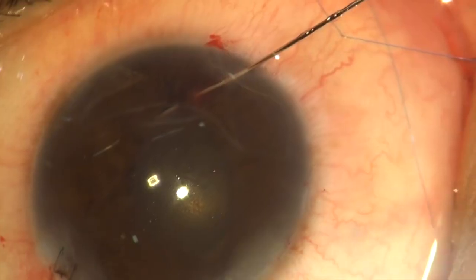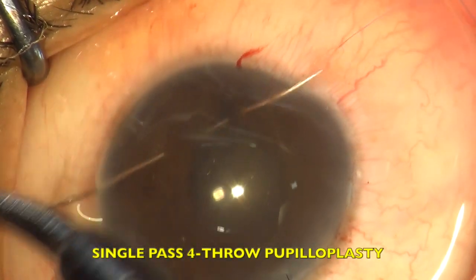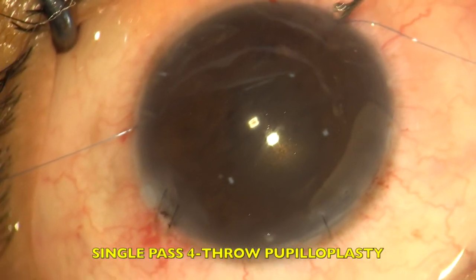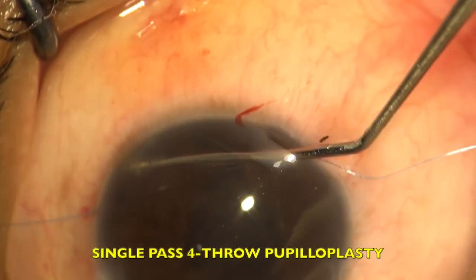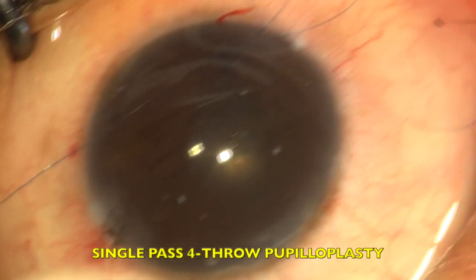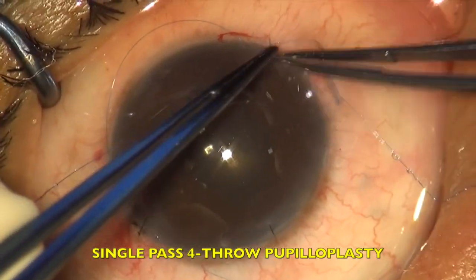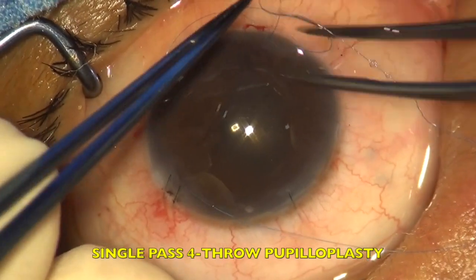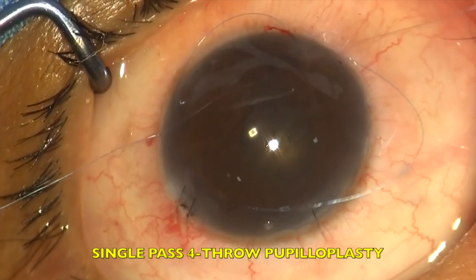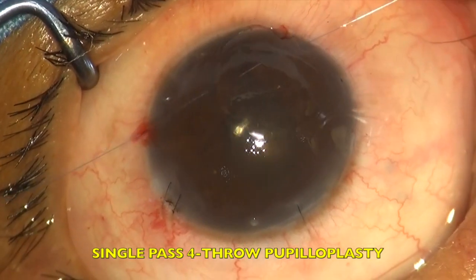The only clinical thing that is needed to be done in this case is to close down the pupil because it is persistently dilated, and this persistently dilated state leads to further problems in the eye. Hence, in this case, typically, the patient had undergone a cataract surgery. The vision was absolutely normal for this patient, but the patient had raised intraocular pressure and a lot of glare and photophobia because of the persistently dilated pupil, and this patient was a very unhappy patient even though the cataract surgery was absolutely normal.